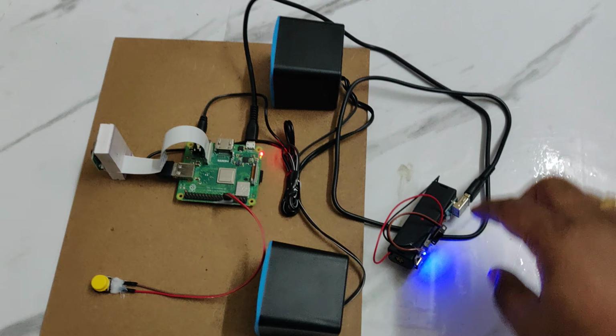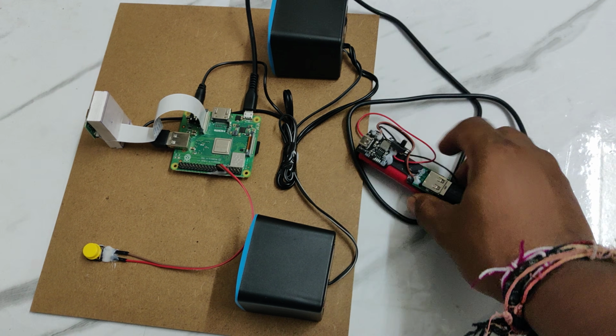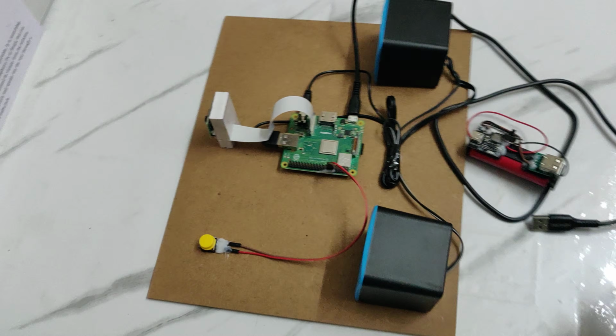Based on blur, proper printing, and no watermark, you will get exactly the proper voice announcement from this. And the process is like this: initially switch this off, disconnect, and keep it charging, and next switch this on and connect that. So that's the process. Thank you.